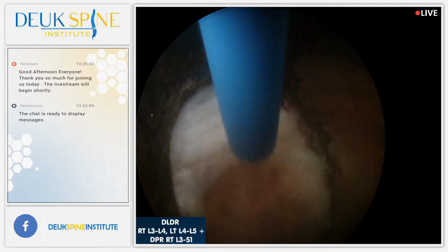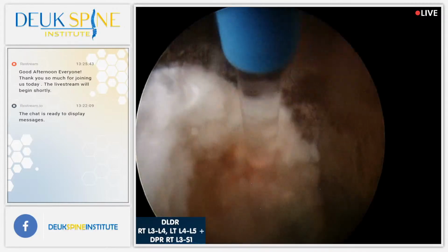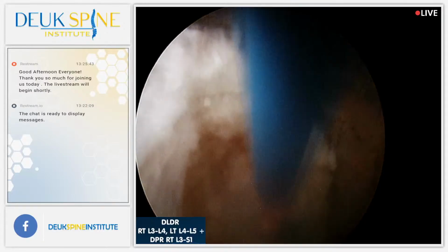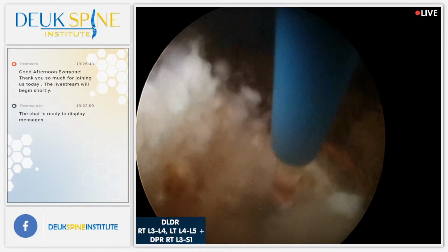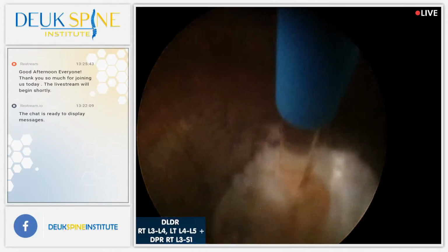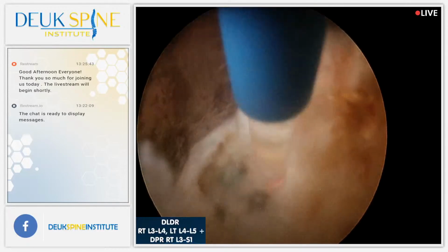We're almost done with this disc, Dr. Berndes. Like I said, the next one, he looks like he's actually almost auto-fused the disc. That's what it feels like. So I don't know how much we're going to get, but we'll try to get as much as we can, and then we're going to move on to the facets.